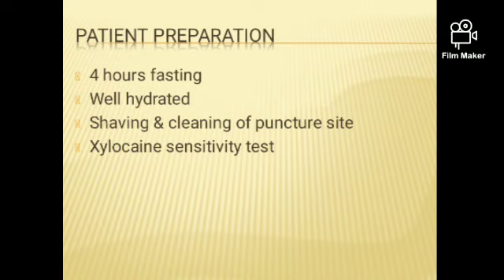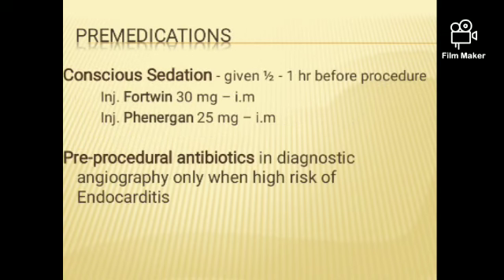Next is shaving and cleaning of the puncture site, and you have to do a 1 ml sensitivity test. Why a sensitivity test? If you don't do a sensitivity test, you will not be aware whether the patient is having an allergic reaction or not. Some people may not have any kind of allergic reaction, but may have a reaction to contrast media or medicines. So this test will give you a confirmation. Just take 1 ml contrast.